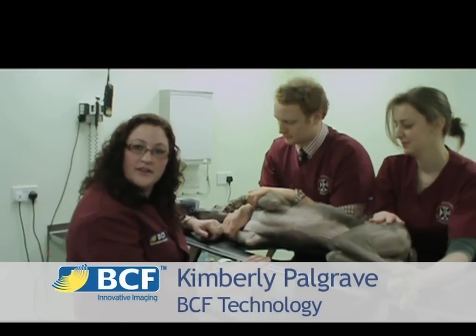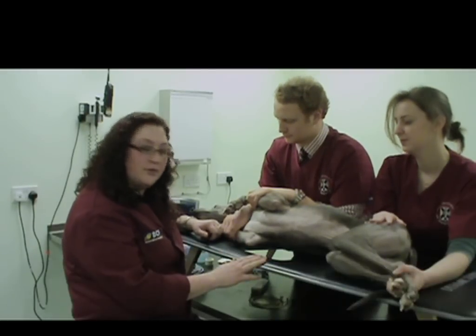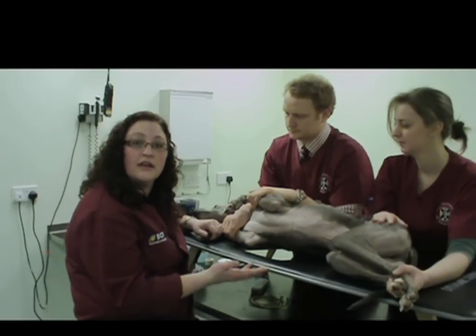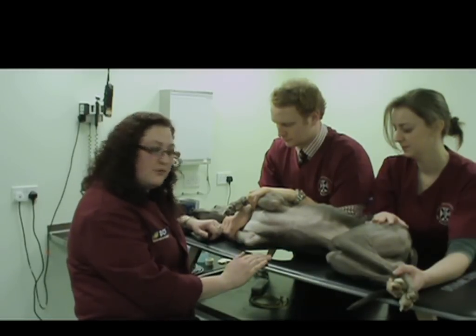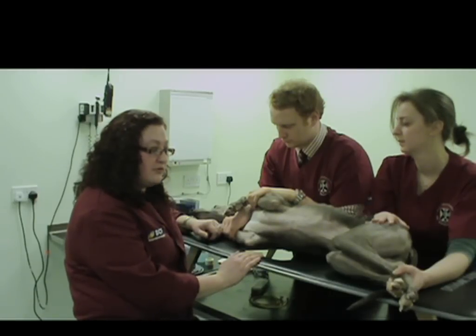Hi, my name is Kimberly Palgrave and I'm the in-house vet for BCF Technology. Today, we will be looking at how to perform a basic echocardiographic exam in the general practice setting. We will look at obtaining the standard ultrasound views that will give you a good idea of what's going on in the heart of most patients that will come through the door.